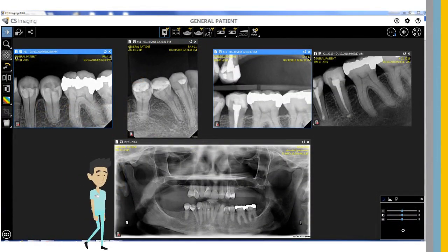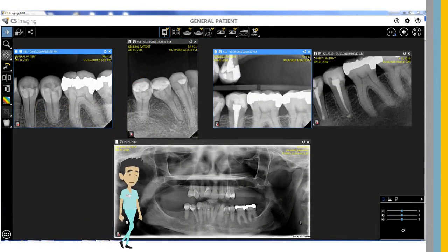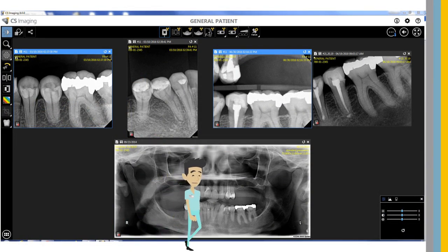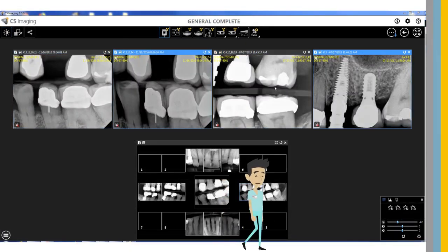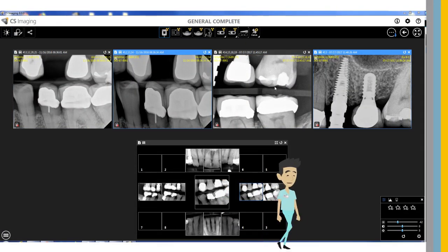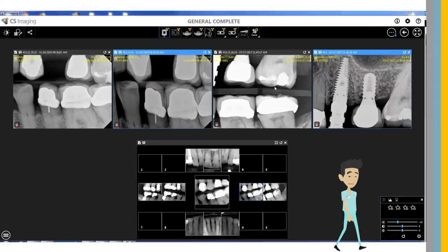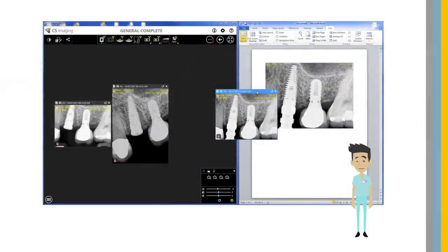Multiple images can now be selected for simultaneous enhancements, which saves time when diagnosing a series of x-rays. You can now drag and drop images to import or export them, or export directly to an email, a document, or a folder. This facilitates better case collaboration and data sharing.